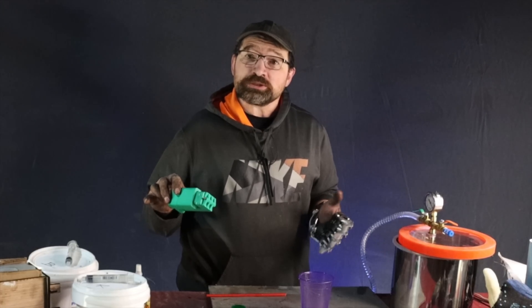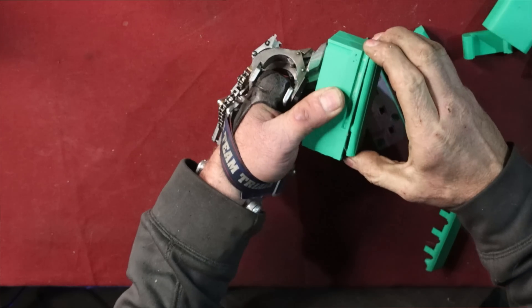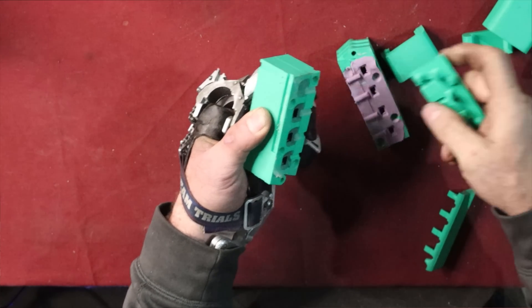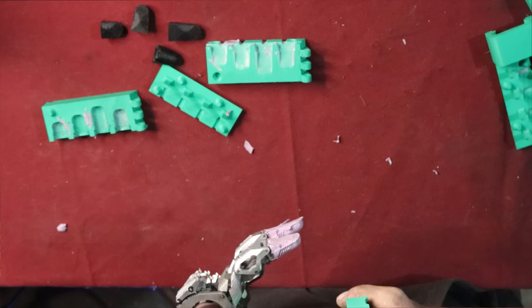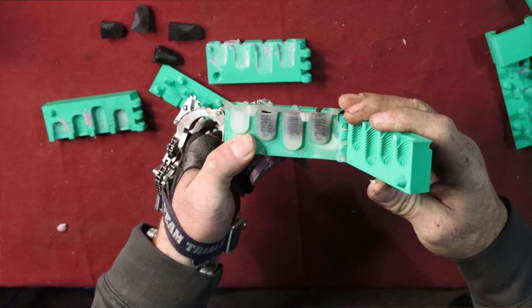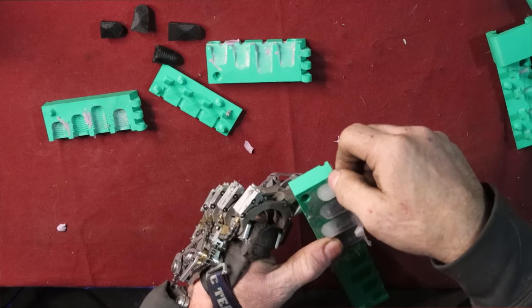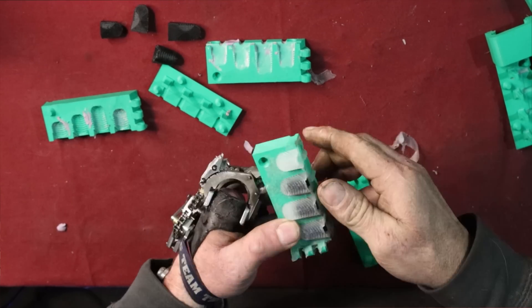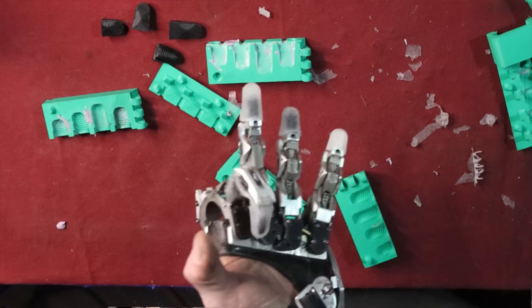Now that the sprues are full, go ahead and put the second clamp on and you're done. Just wait about 24 hours and start the demolding process. After the silicone's cured, release the clamps and carefully pry out the top. Then put your knife in the book match and gently open up the mold, being sure to go slowly enough that the silicone releases from the mold and doesn't just rip. Pull the distals from the mold and remove any of the excess flashing. And there you have it — new distals.